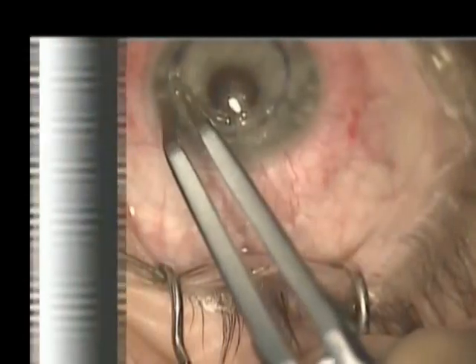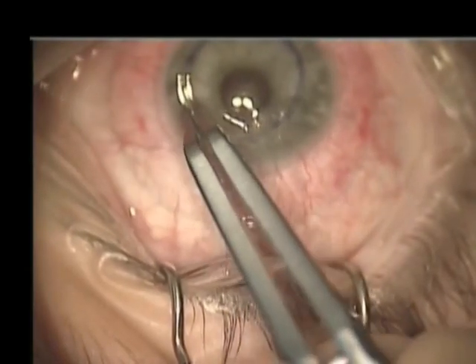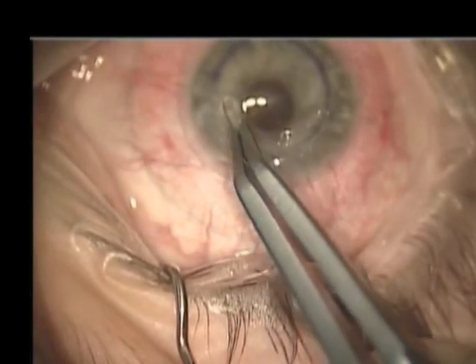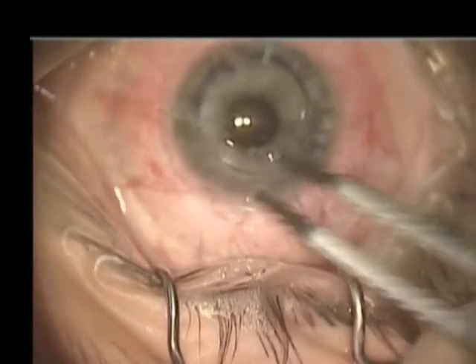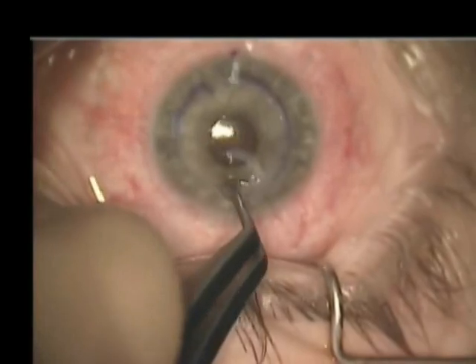The eye is held in the correct position via vacuum. Once the channels have been successfully created, the INTACS segments can be fed into the channels, as demonstrated here with the inferior INTACS segment.